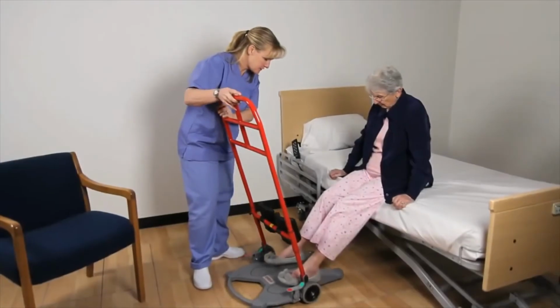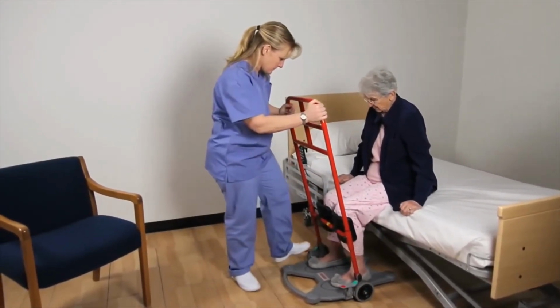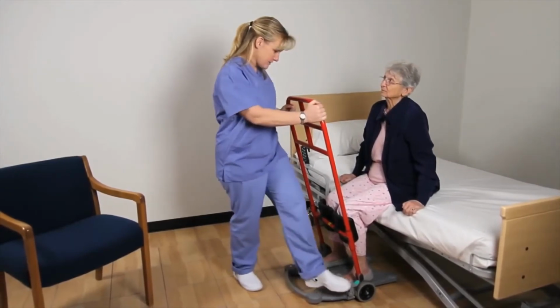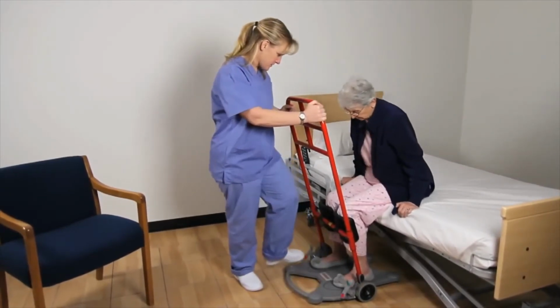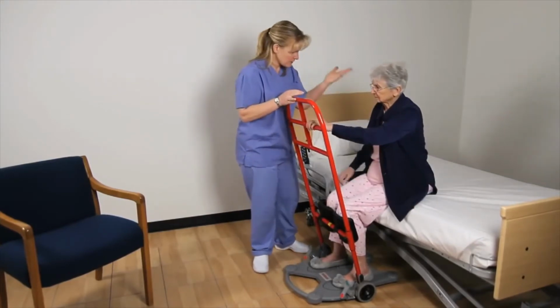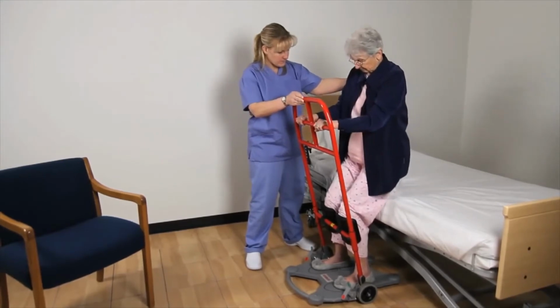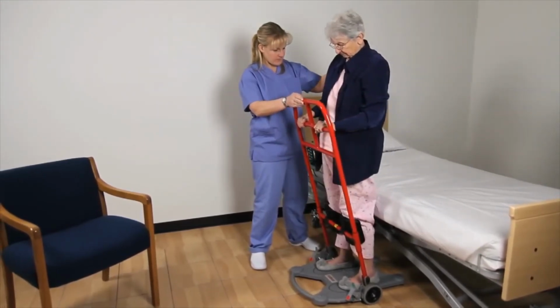We will begin the functional weight-bearing test with the standing assessment. Here we will test the patient's ability to stand in a safe, controlled environment. Always put the brakes on during this test. Have the patient find a comfortable grip on the frame and ask the patient to stand up. If they can, then proceed to the leaning sideways test.